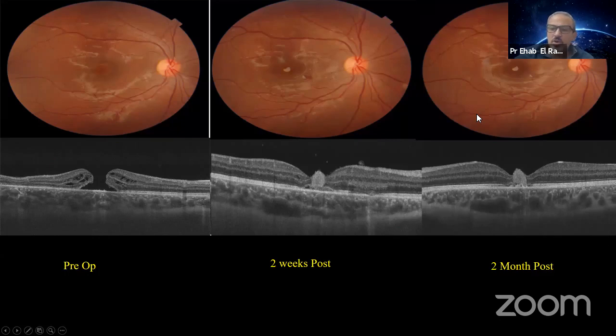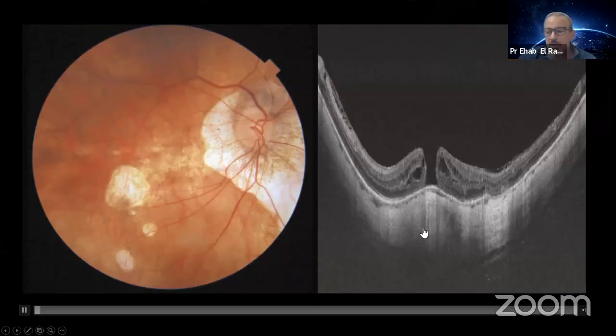We've seen patients where the amniotic membrane stays there for up to 8 months, which is sometimes more than you need. So the question again is, do we need something interfering with the whole healing here? This is a question which I always ask the panel to discuss. And we're doing patches covering things like that. Do we need something inside the hole, or does this interfere with the normal healing process that we should see in these holes? And this might be a last option for really large macular holes, other than the rest of the techniques that we're going to see during the presentation.